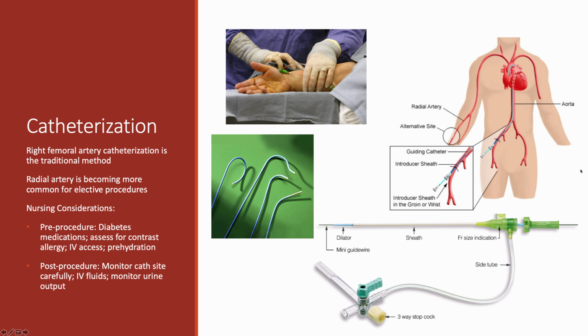So the catheterization uses different catheters. The first thing that has to happen is that we have to put the catheter into the vessel. In this case, it's going into the groin, and this is a long sheath that's put in over top of a guide wire using a technique called the Seldinger technique. And then these catheters are shaped especially so they can go directly into the coronary artery without much effort at all, really. You put the catheter in there and it finds the coronary artery. That's how they're designed. It's pretty cool, actually.